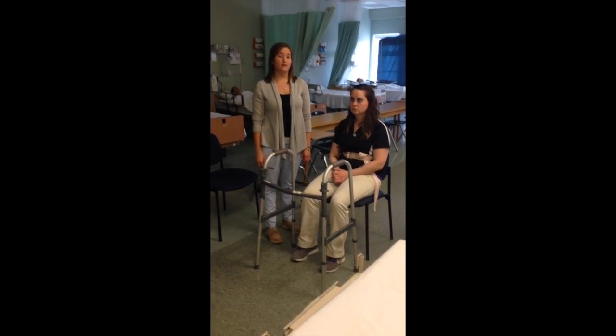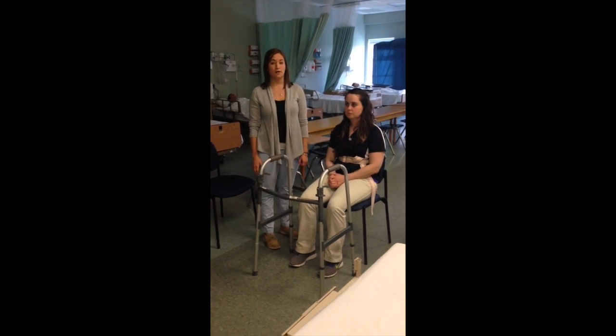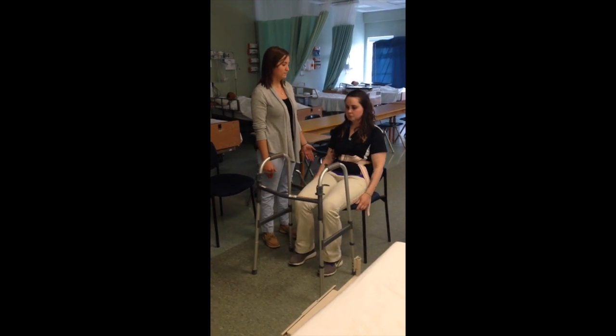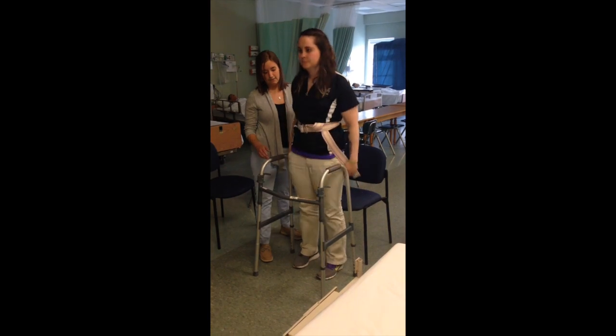In order for the patient to do this, they're going to scoot to the edge of their chair, lean forward, and then reach for the walker once standing. So then, I'm going to have you scoot to the edge of your chair, lean forward, you're going to stand up, and then reach for the walker.